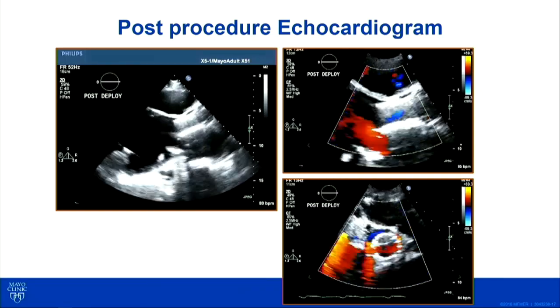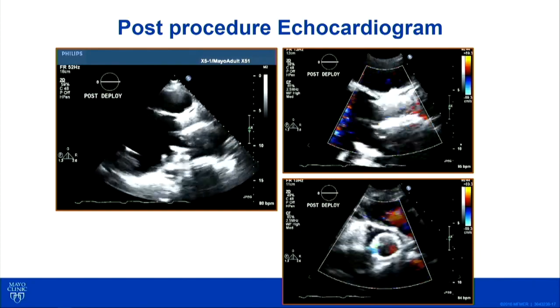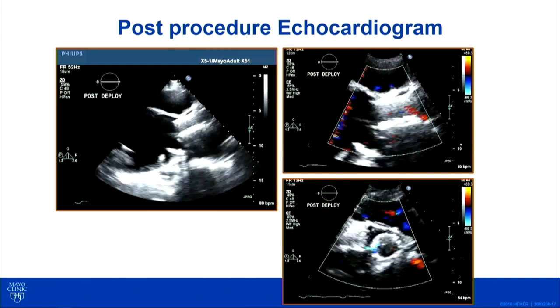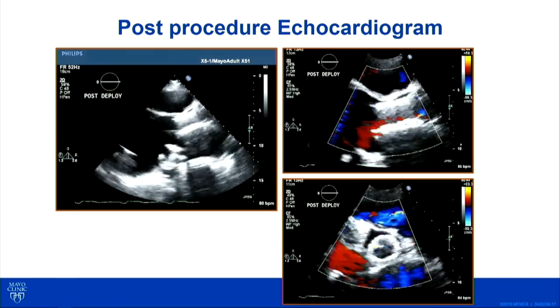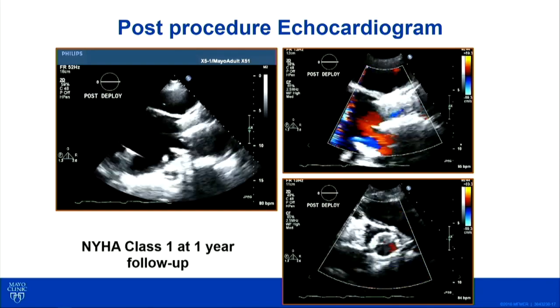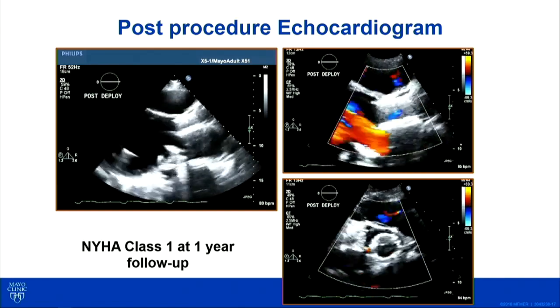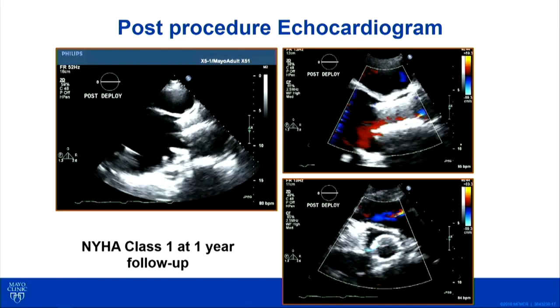These are the patients that we would be very careful about monitoring for the next 12 hours or so to look for migration of the device, as the LVAD continues to have that force pulling the valve into the ventricle. We also keep the rates lower on the LVAD device. In her case, she didn't require a second valve, but there is a significant rate of requiring a second valve in this population. Oftentimes, if that does occur, we would use a SAPIEN valve, a 29 millimeter with additional volume, which tends to get a very nice result. This patient has been doing very well. She had improvement in her functional status, and at 1 year of follow-up, she's doing great.